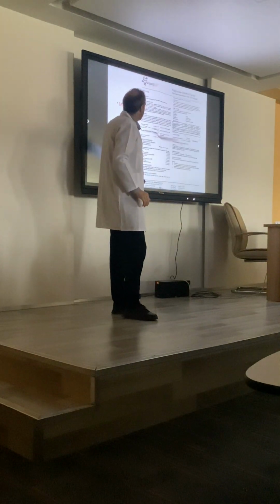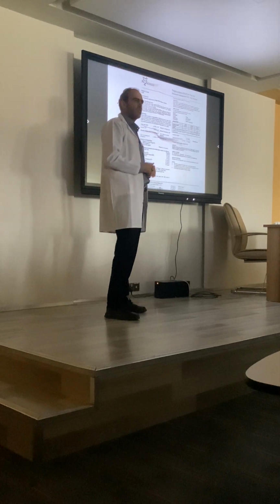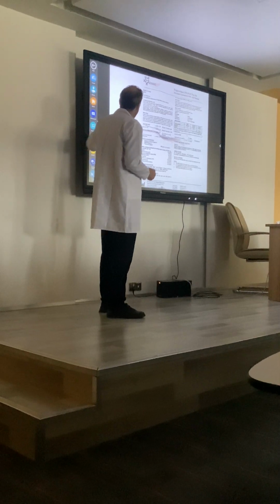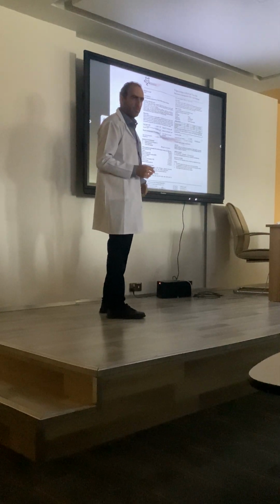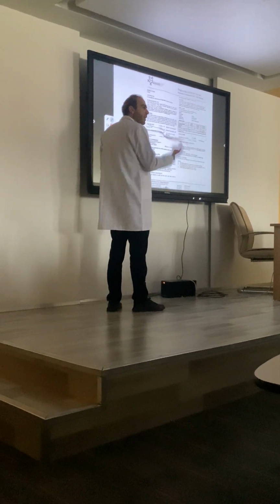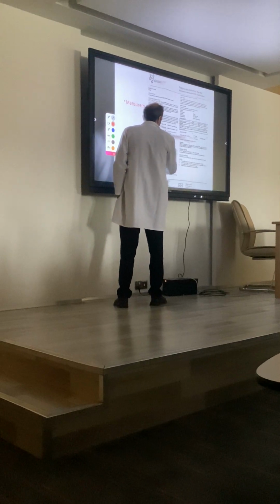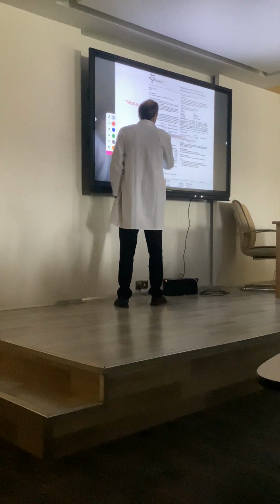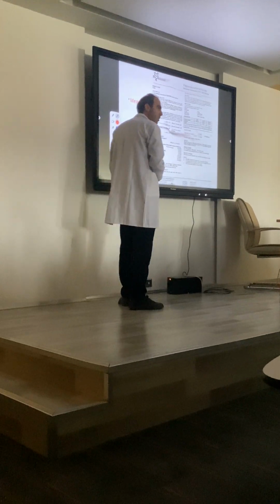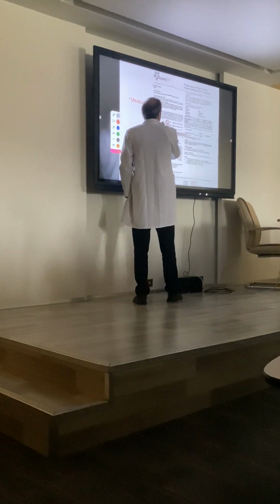That was HDL. The next one is triglyceride. The quality here is not good because I actually took a photo and the photo wasn't good. But here is what you need to know about the triglyceride measurement. For triglyceride, we have reagent number 1 and reagent number 2. Reagent number 1 has the enzymes and reagent number 2 has a buffer. What enzyme do we need? The lipoprotein lipase.